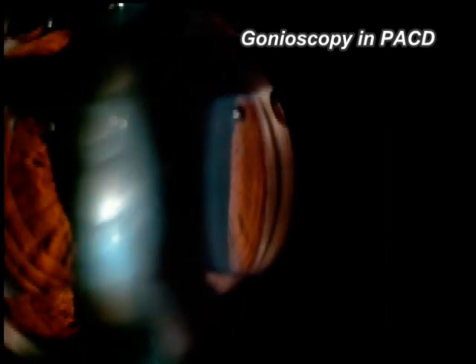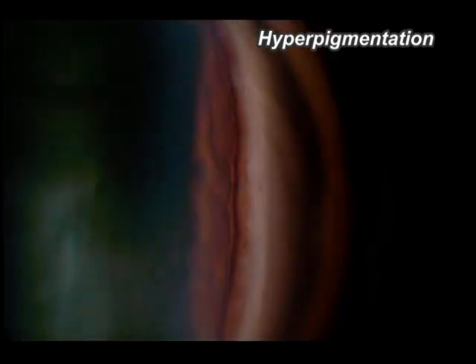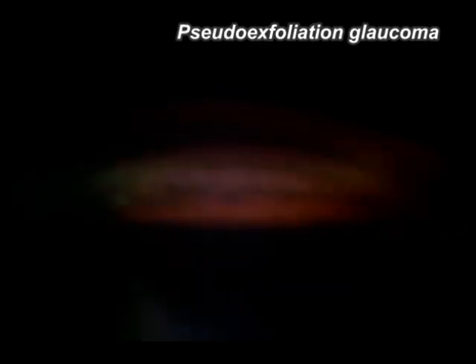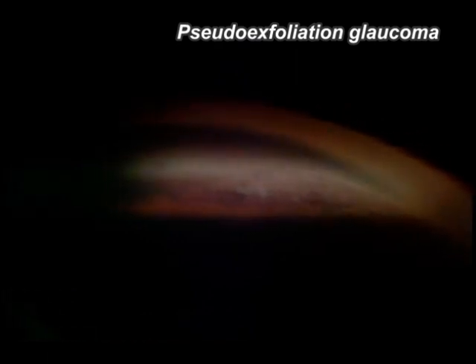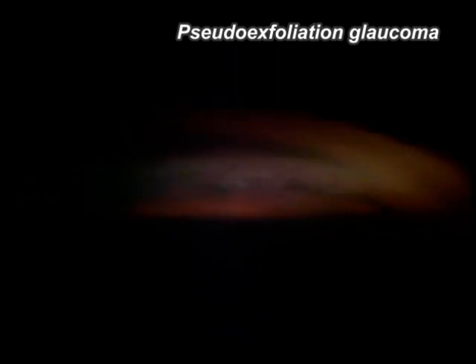This video has shown the closed angle in different situations. Now this angle is showing hyperpigmentation — you can see a lot of pigmentation in the angle. This is the angle in cases of pseudoexfoliation glaucoma, where we can see fluffy matter, hyperpigmentation, and an open angle.